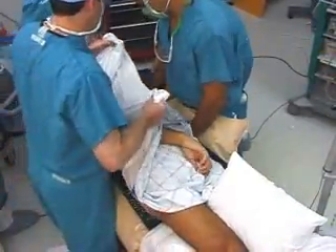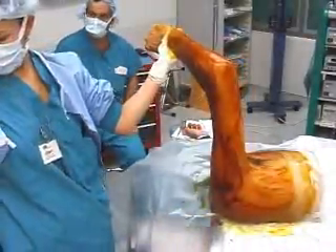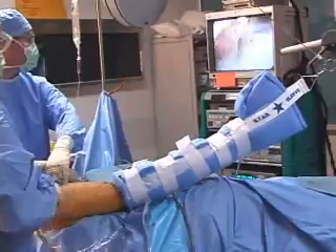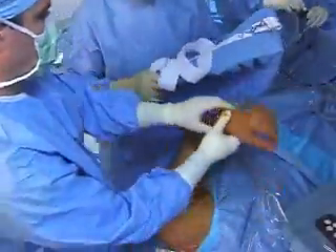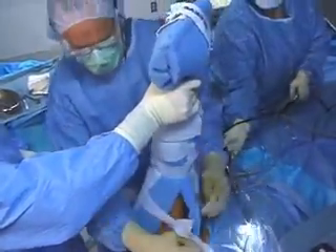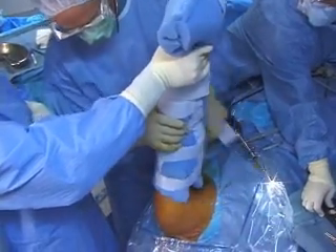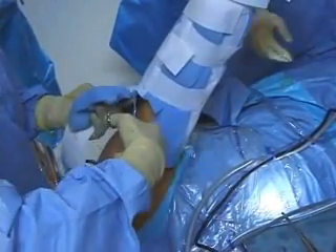Once the three-point shoulder distraction system is properly positioned for the anticipated procedure, the patient is prepped in a routine manner. The Arthrex Star Sleeve is a sterile soft foam device packaged sterile, specifically designed for use with the three-point shoulder distraction system, and provides non-adhesive rotational control of the upper extremity during all routine shoulder arthroscopy. After applying sterile drapes, the Star Sleeve is first measured to the patient's arm length. If the patient has a short arm, the excess foam can be trimmed from the sleeve end so that the sleeve will not interfere with the operative site.